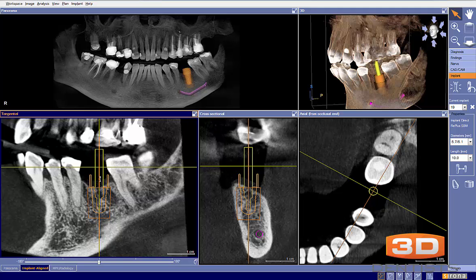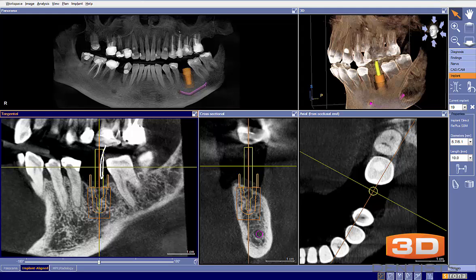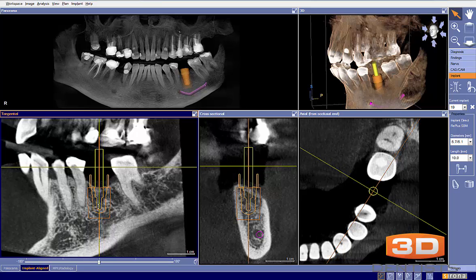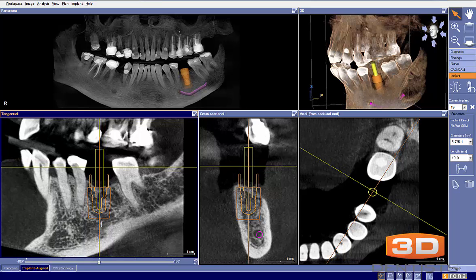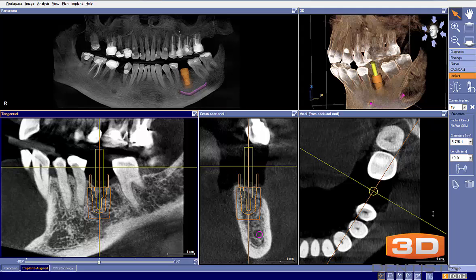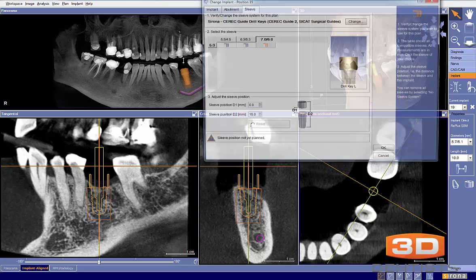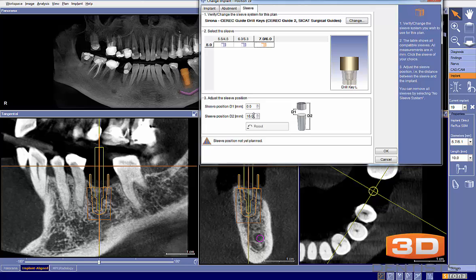Now we can see that our curve of Spee is more straight and we're going to have long-axis loading. The challenge is the implant has moved more to the distal, so we simply move our implant to the mesial — just like so. Now we have the best of both worlds: a much better curve of Spee and a centered implant. That should pretty much take care of our implant positioning.